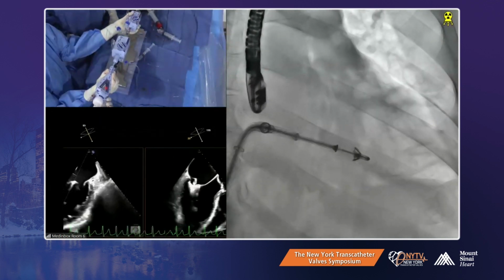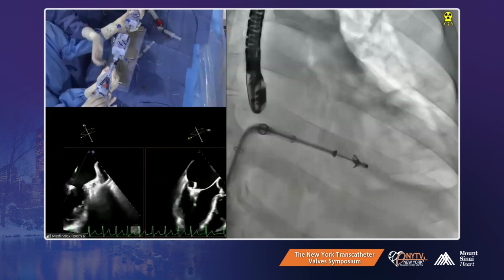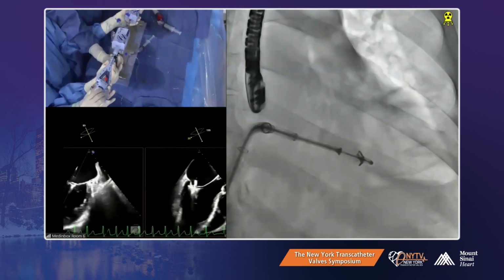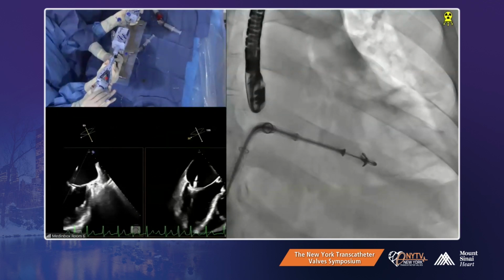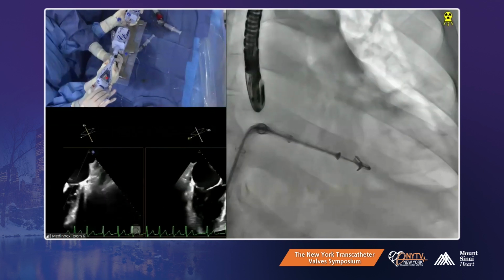Yeah, drop the grippers. This is great. We dropped the grippers. Okay, you're gonna get the best you can. And you can see you're no longer, the shaft's no longer oriented. Close. Yeah, close slow. We are closing the clip.